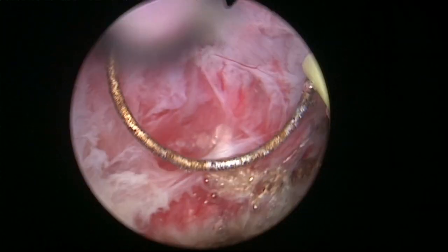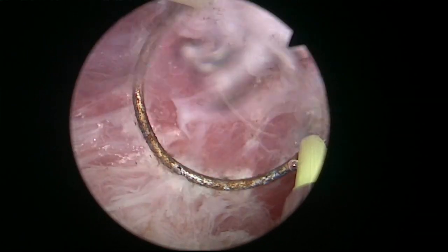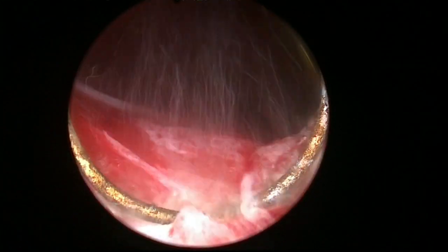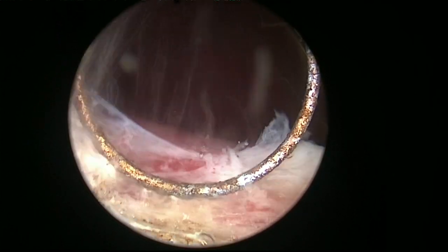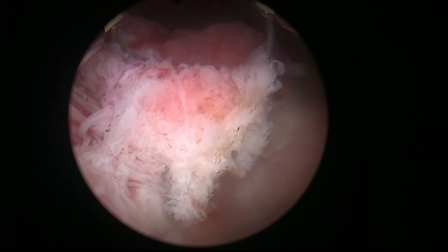You see, it looks very frightening with the laser, but when you go in with the resectoscope, it's not so frightening. You can see? I think the balloon will stop this. Nothing major, yeah. It's coming out basically very clear, I think.